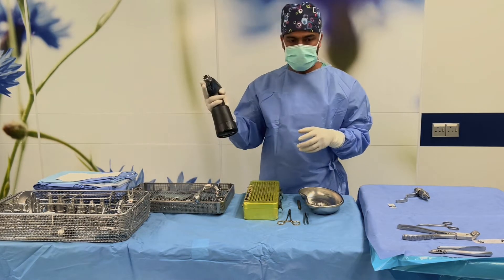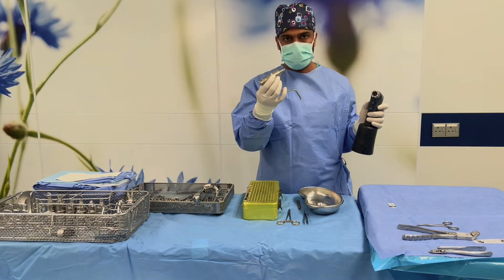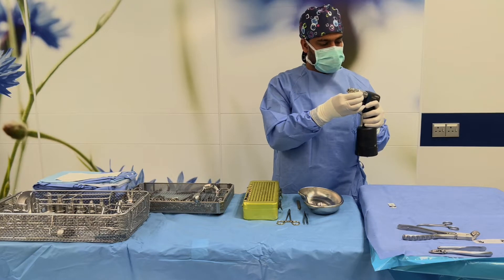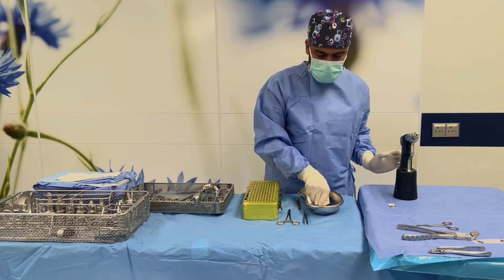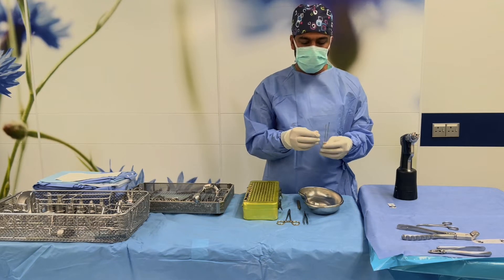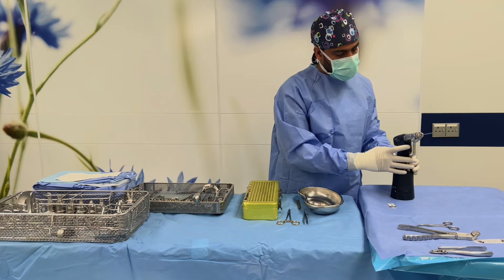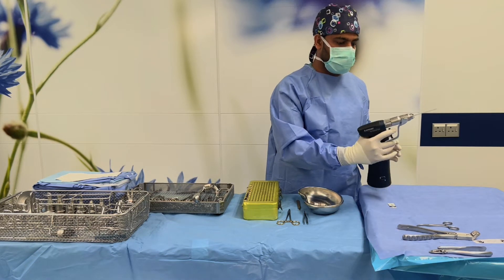It is working. This is the special connector for the K-wire drive. We have different size K-wires here. For this surgery, we use 2mm K-wires. Fix the K-wire — okay, it's working.